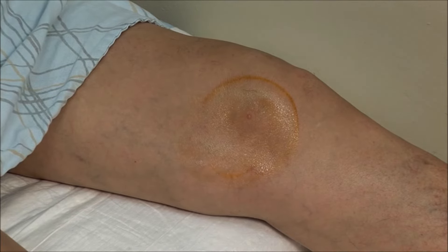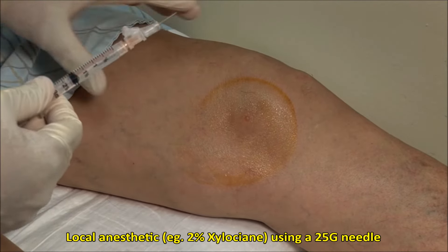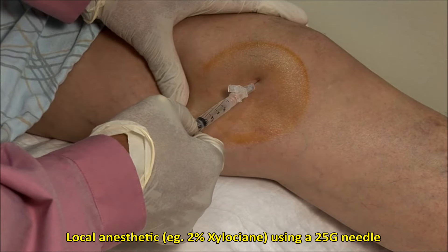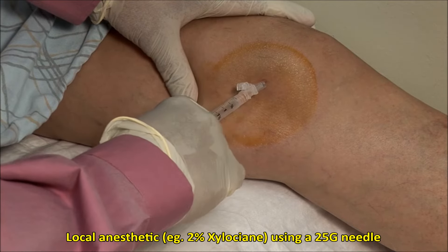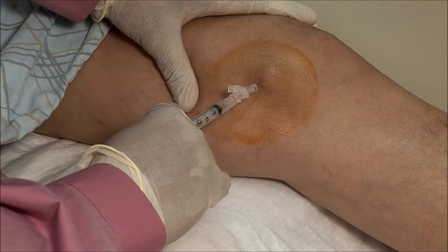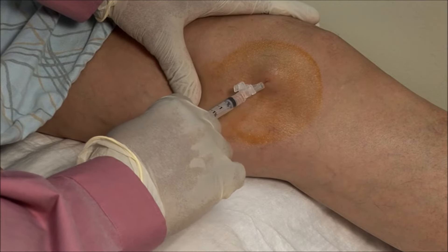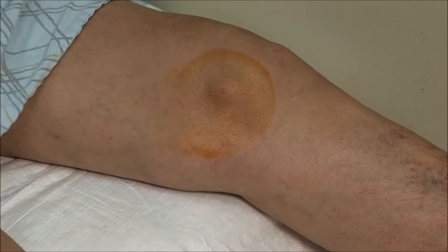Allow the area to dry a bit and then use local anesthetic. I will apply 2% xylocaine using a 25 gauge needle into the subcutaneous tissue and under the skin, forming a bit of a bleb. Wait a couple of minutes for this to take effect.